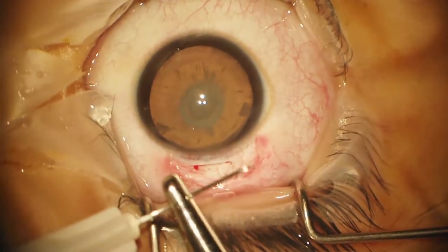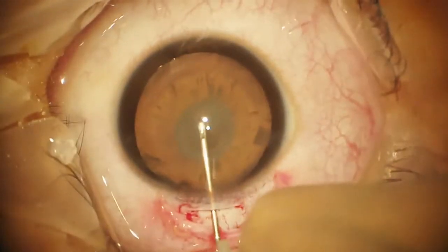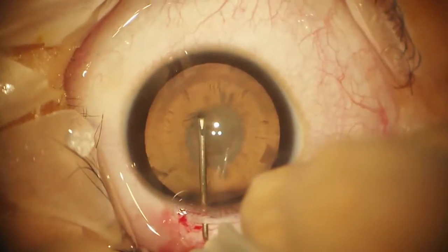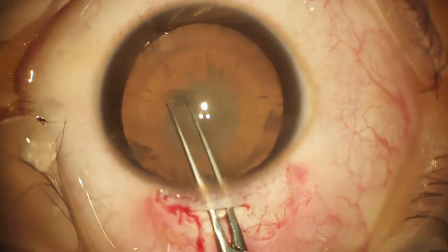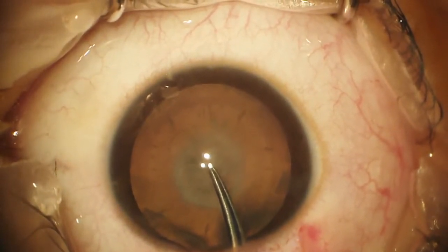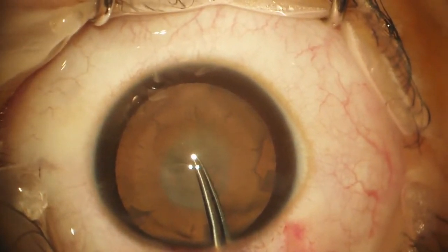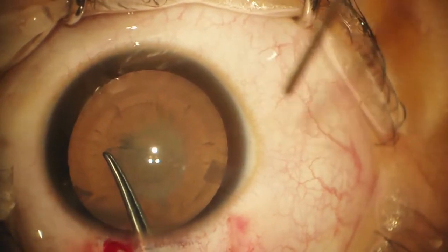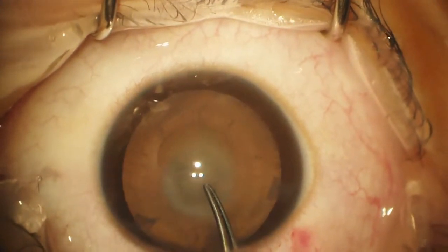I'll just get the capsulorhexis started. Remember, being a child, this will have a very elastic capsule. We'll start toward the middle and then switch to the capsulorhexis forceps. We're going to try and make the capsulorhexis relatively small. No hydrodissection — we don't want to hydrodissect because if there is an opening in the capsule, we can blow right through it by hydrodissecting.